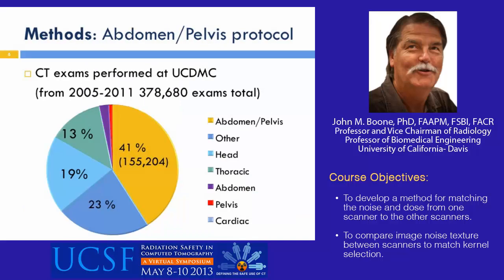Here is just a pie chart showing the prevalence of abdomen pelvis protocols at UC Davis on slide 6 here. At our institution, as well as many others, the abdomen pelvis CT scan is widely used for a number of different indications.